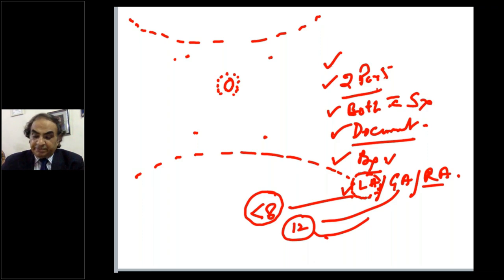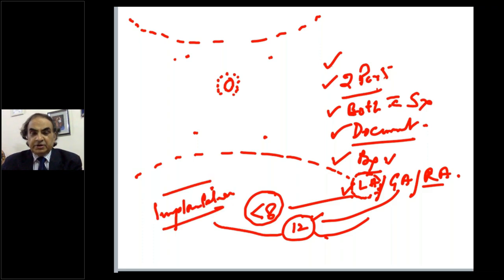So remember that. Now, if the pressure is 12 and you take a biopsy while you're still going to carry on with that pressure for some time, you're likely to cause implantation. And the very old concept, which I'll discuss with you, including my own publication on the port site issues, where there can be port site metastasis or port site tuberculosis, or many things can happen. So don't take a biopsy now there because you'll create a raw surface. When you finish everything, you can leave a mark there. You can come back and take a biopsy, and that's the last procedure you do.